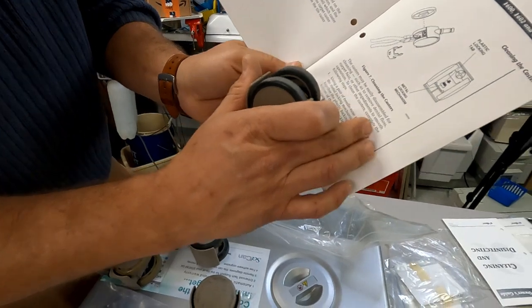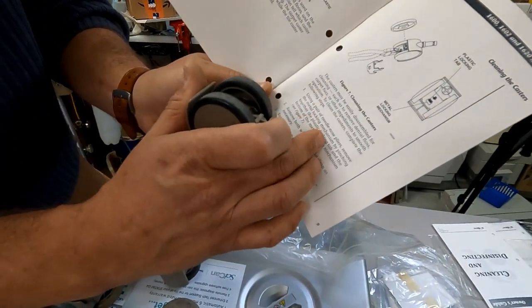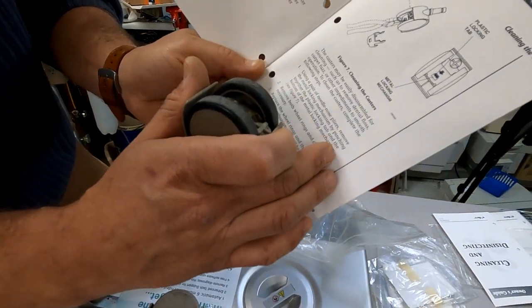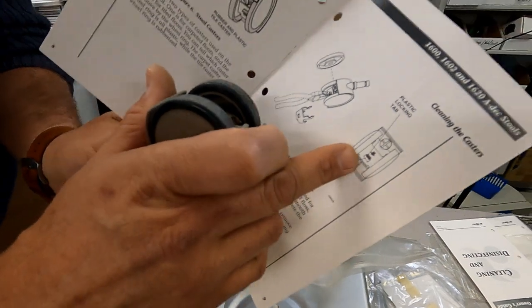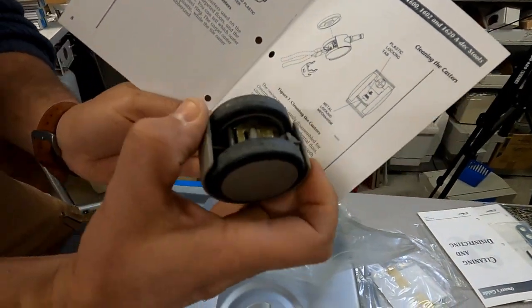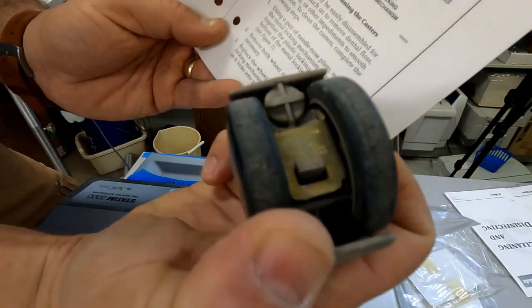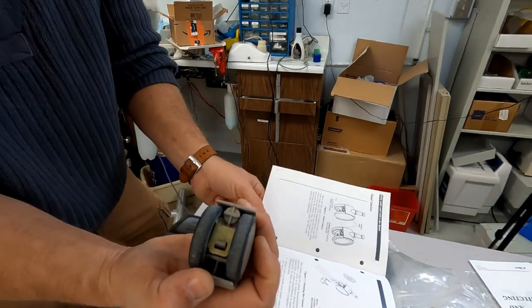So to clean the casters, complete the following. Using a pair of needle nose pliers, remove the metal locking mechanism by pinching together the plastic locking tab and the bottom of the metal locking mechanism. And so they're going to give us a little picture here, and they're going to say plastic locking tab and metal locking mechanism. There we go. Plastic locking tab, metal locking mechanism, and then the wheels are going to come out. It says they're going to come out.